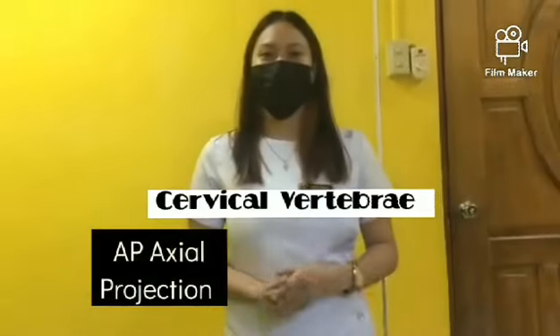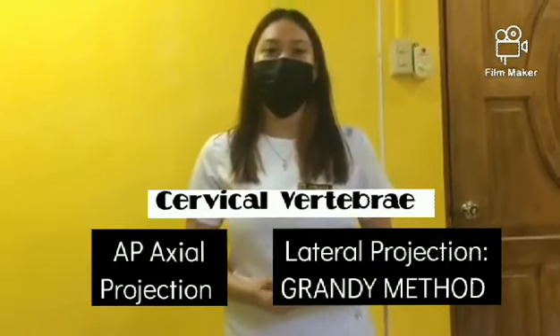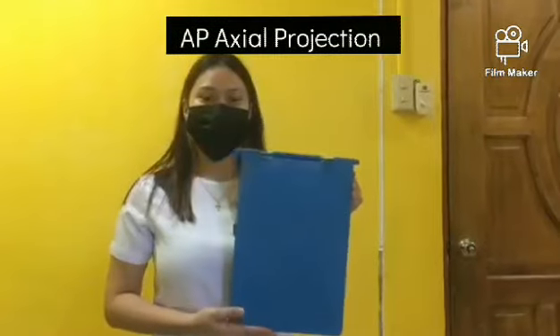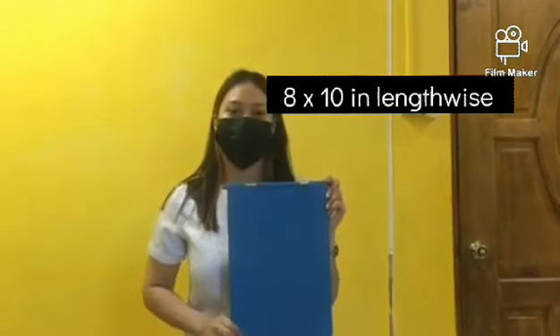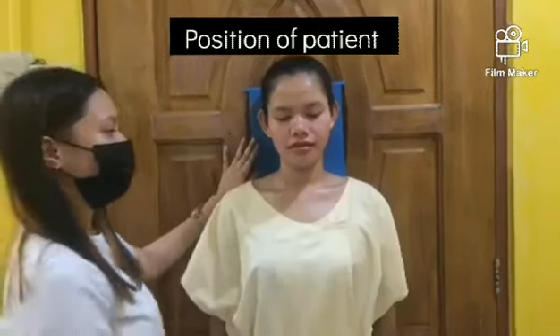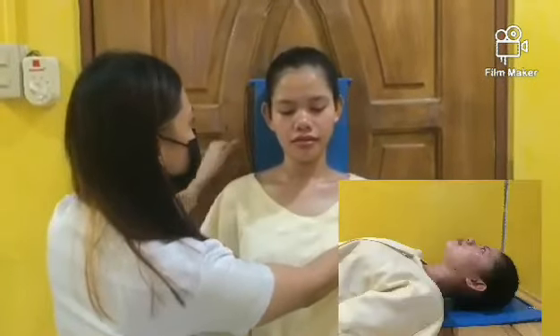So today I am going to demonstrate AP axial projection and lateral projection Grandy method for the cervical vertebrae. For AP axial projection, I am going to use 8 by 10 inches or 18 by 24 centimeter lengthwise image receptor. The patient is placed in the AP body position. It's either recumbent or upright.